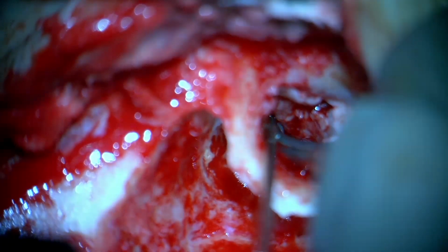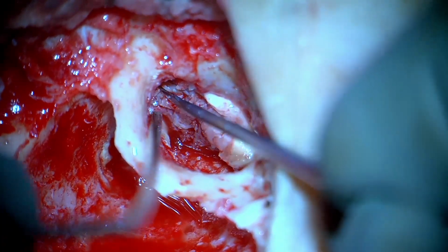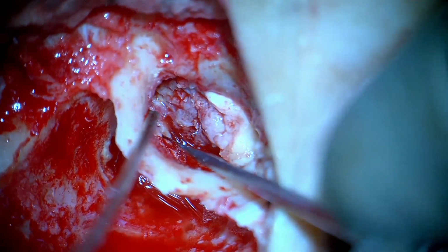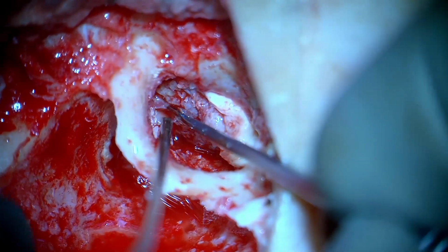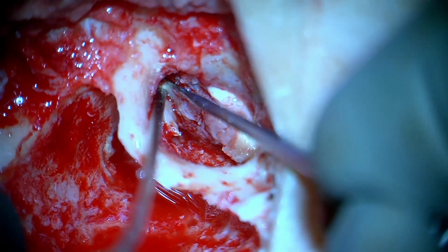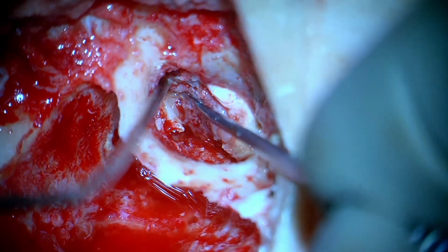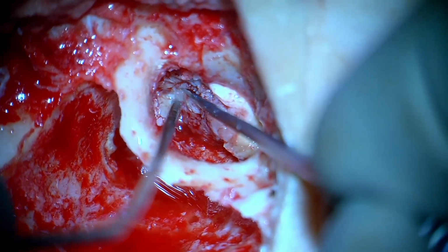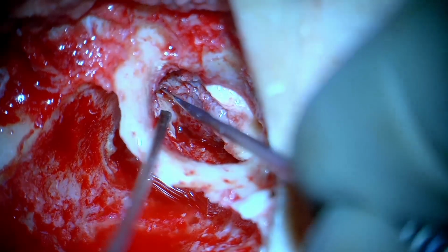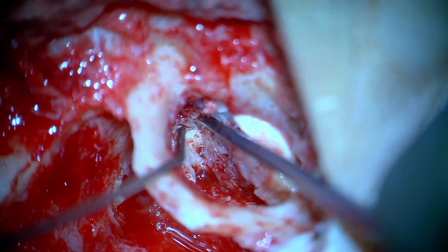Now see, we are lifting the retracted posterior drum from the middle ear ossicle, that is the incus, and then probably more, until you see this, the incus, lifting from the short process of incus. You see how posteriorly pushed is the canal wall. We haven't drilled much posterior superiorly, and you see how you can practically see the entire short process and body of incus with the amount of erosion of canal wall that you saw.